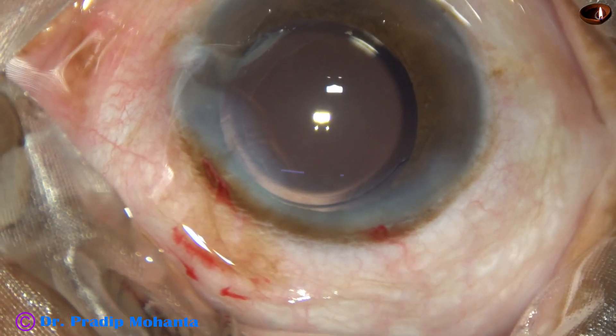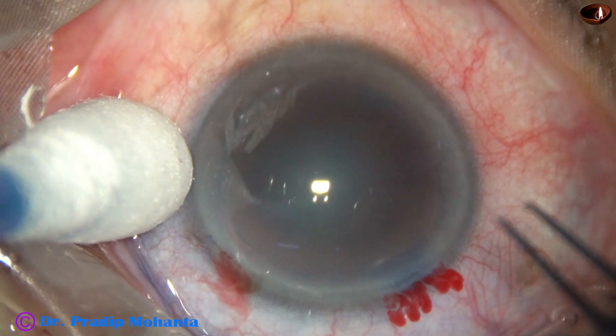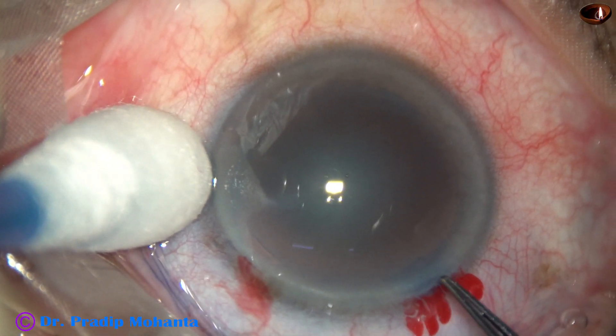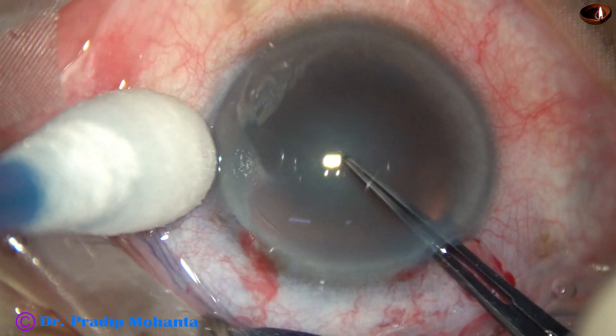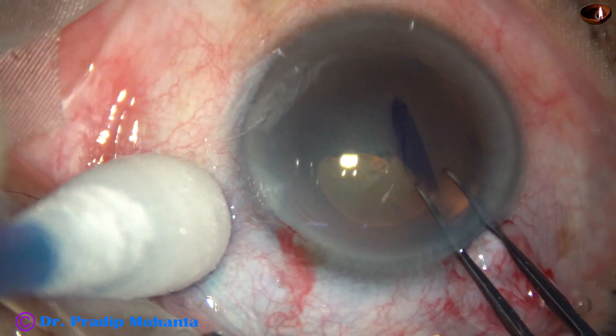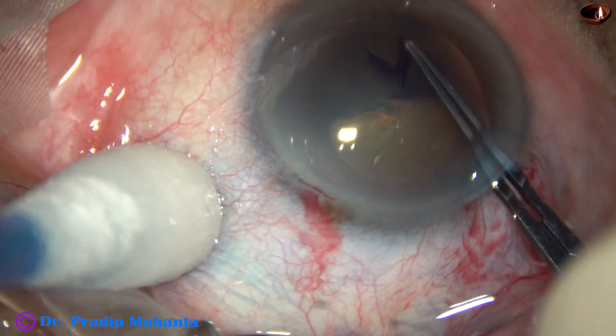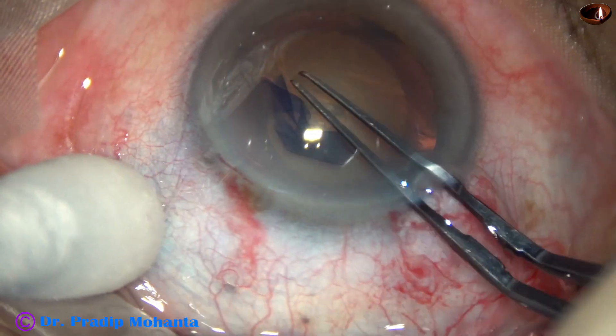Let us observe Stop and Chop technique and Hybrid IA in another patient. Nuclear sclerosis in this case is about grade 2. This is capsulorhexis — the anterior capsule has been stained with trypan blue dye. In this case, the main wound and only one small side port has been made.